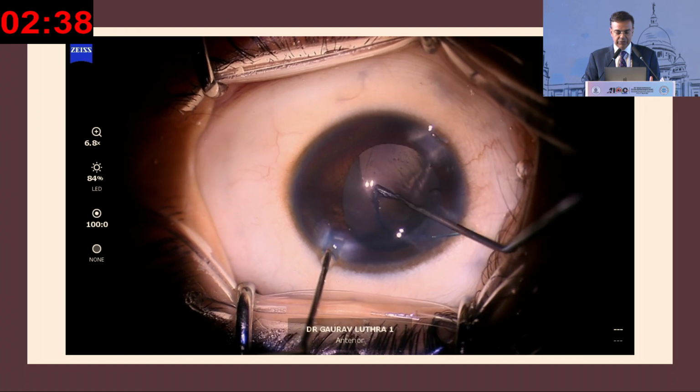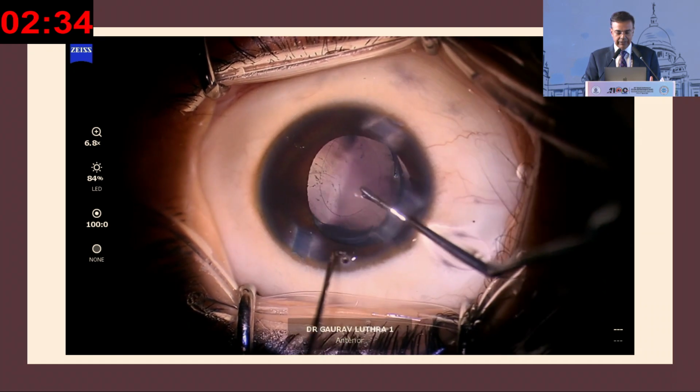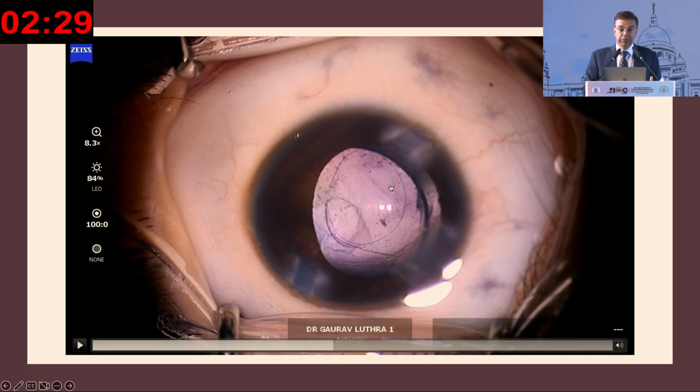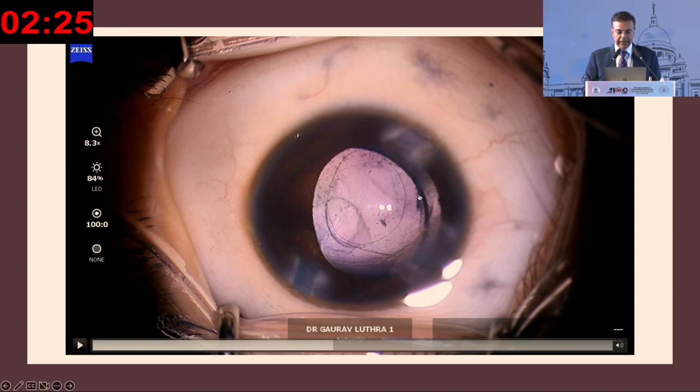I decide to use a dialer or a Y-tipped manipulator to dial it in, and as I dial it in, I realize that something is wrong. There's a PC blowout because the IOL is too big for the bag. So now I have a dislocating IOL, and I have a small rhexis through which I have to retrieve this lens.